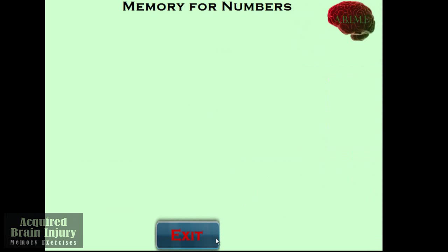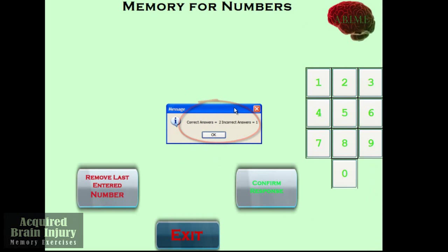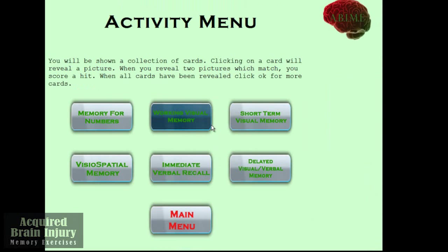I'll confirm and then click exit and I get the exit request here. And now it indicates that I have two correct and one incorrect answers. So this is an example of how the program keeps score.